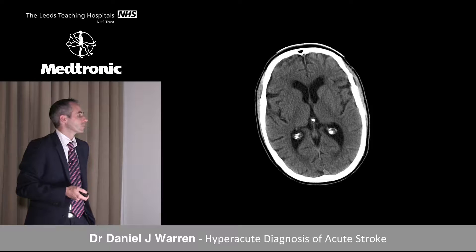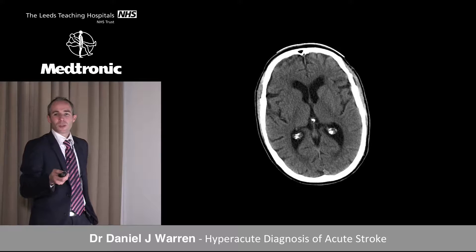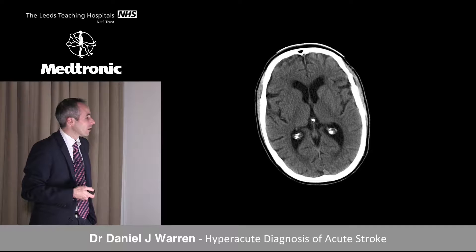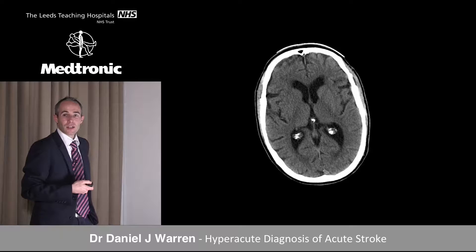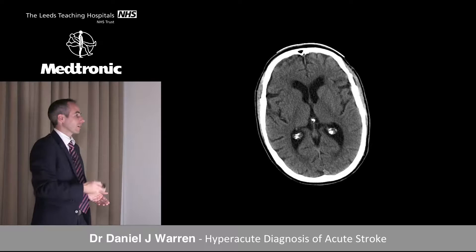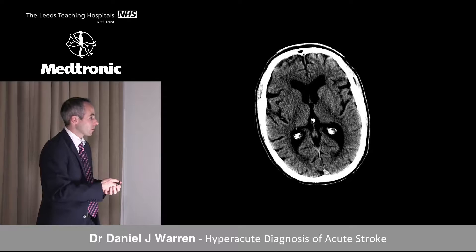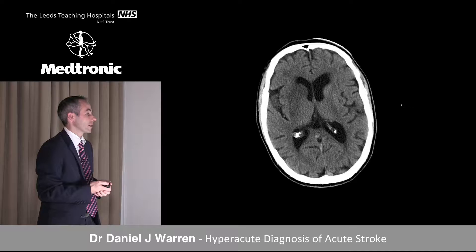On another case, the right MCA area is implicated. There's loss of the insular ribbon and the lenticular nucleus. If you're not sure, a useful technique is to narrow the window — make the grayscale a little bit darker. When we alter the windows, we can now clearly see we've lost the lenticular nucleus, whereas it's very bright on the contralateral side. At 24 hours, the completion of the stroke is confirmed.